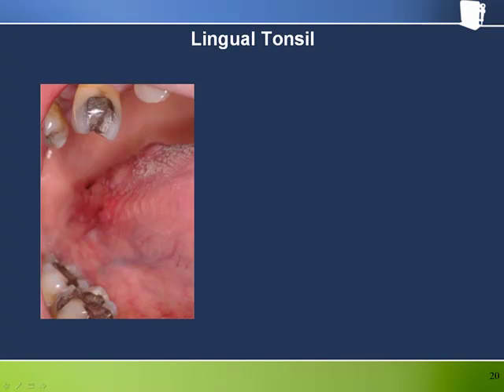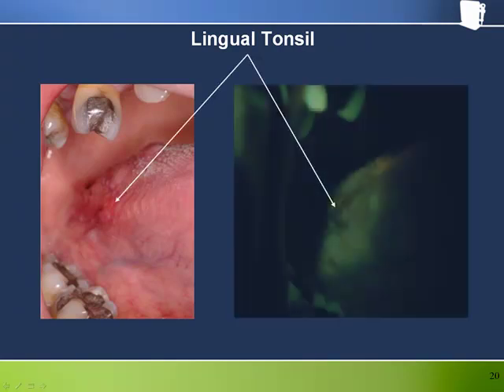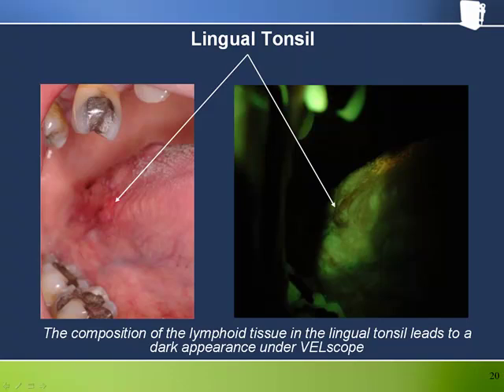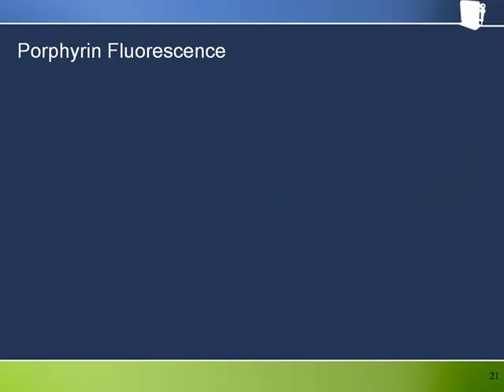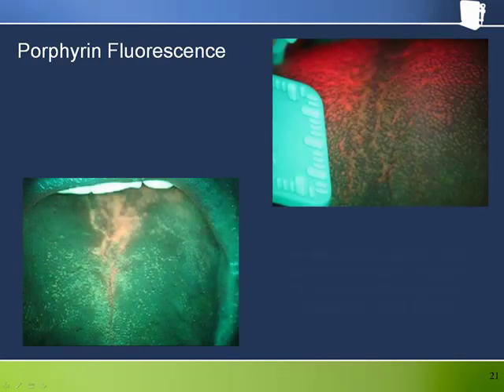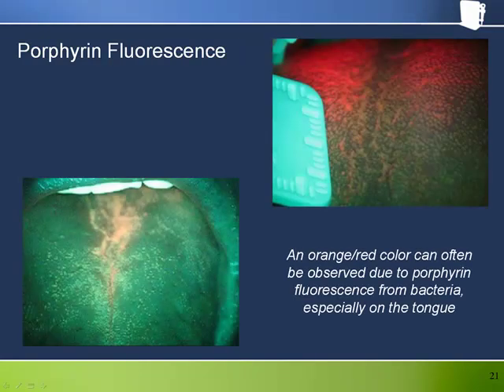After seeing the pronounced loss of fluorescence associated with lymphoid tonsillar tissue, it should be no surprise that the lingual tonsils also present quite darkly under fluorescence visualization. Here we see two examples of the orange-red color from the porphyrin fluorescence generated by bacteria. The tongue is the area most commonly observed, and it's quite common for bacteria to get trapped amongst the carpet of filiform papilla or in the fissures that can sometimes develop.